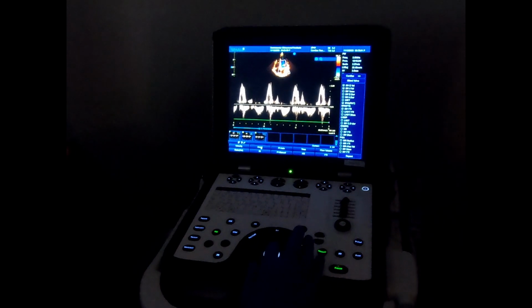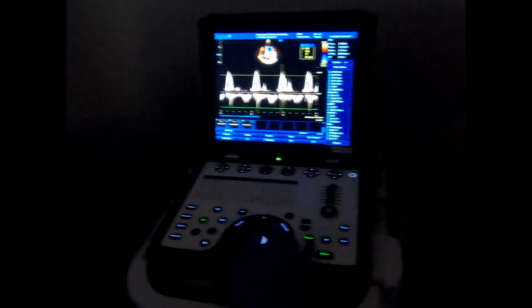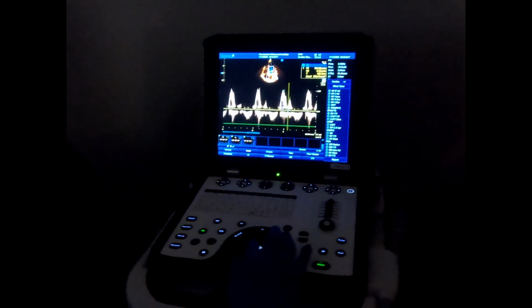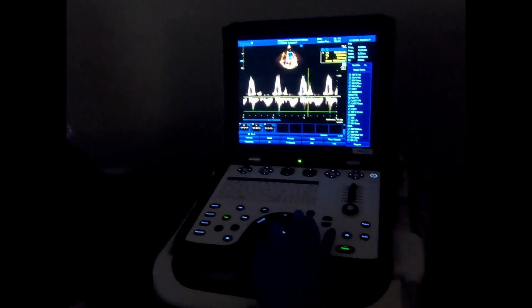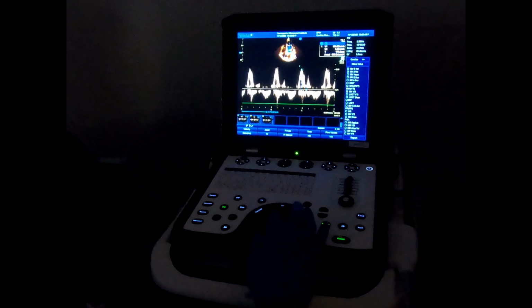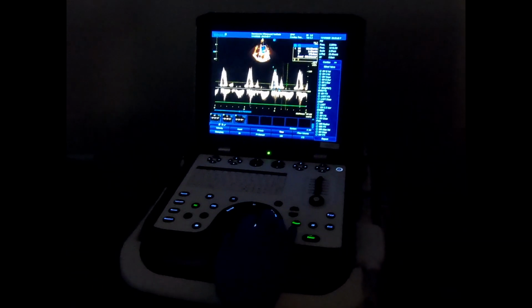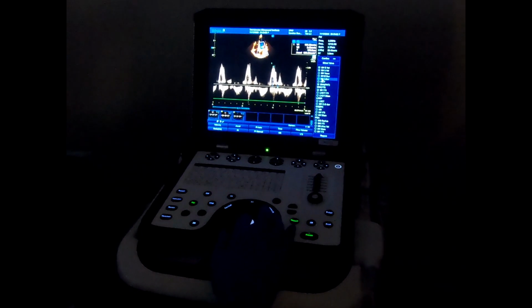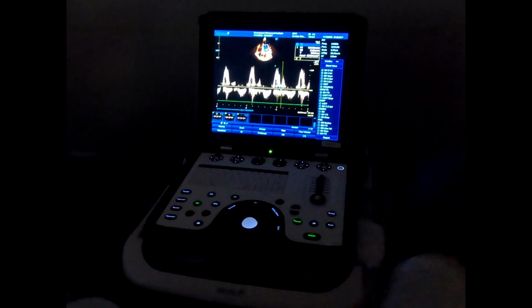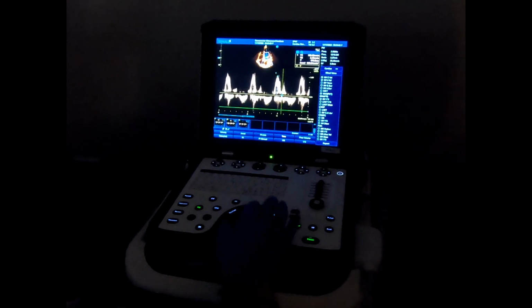Yeah. So now I'm using this one, the one that you have on the screen itself. Do we need to do that? Well, I'm giving you all these options. Okay, so we could do that first and then go back to the. Yeah. Okay. And then you can use the time. See, you don't have a time here for that, although you have a duration here, but I'm saying that if you don't have the A duration in some of the machines, measure from the baseline.